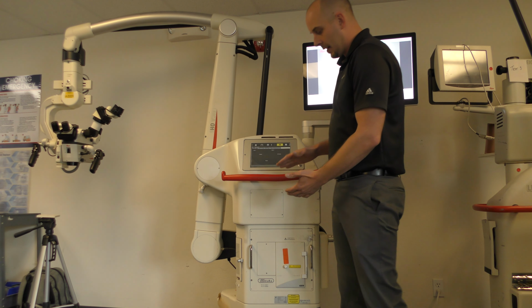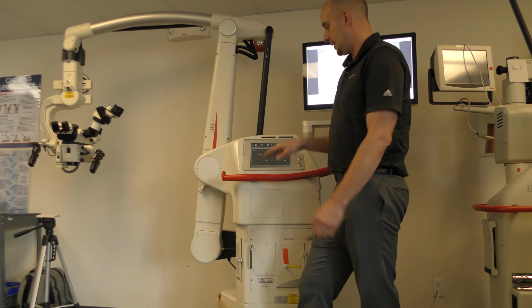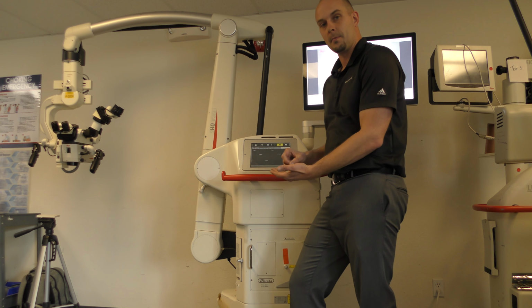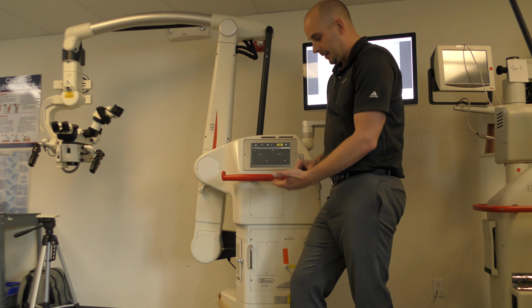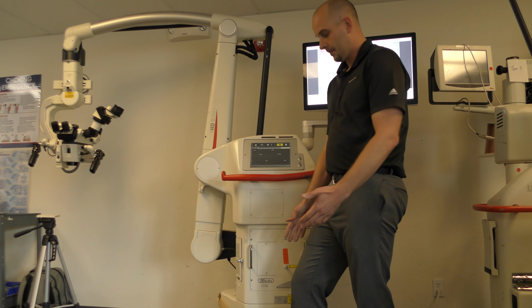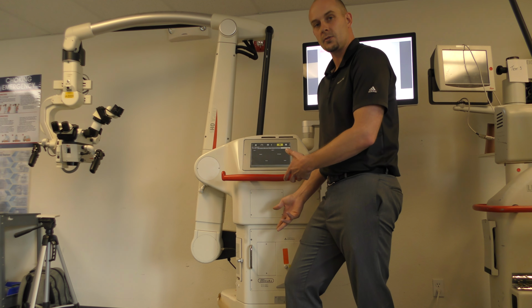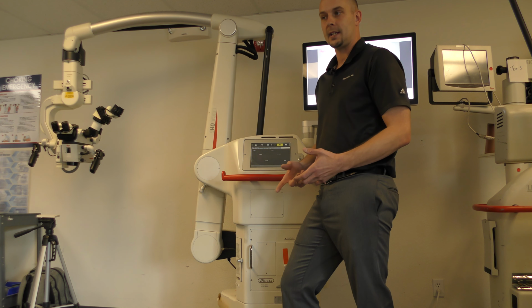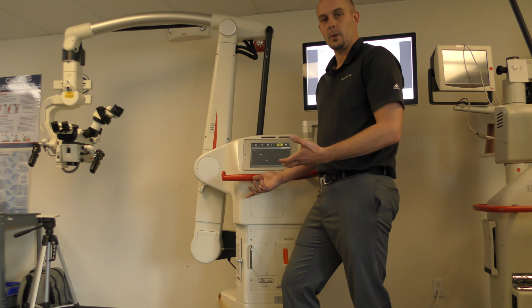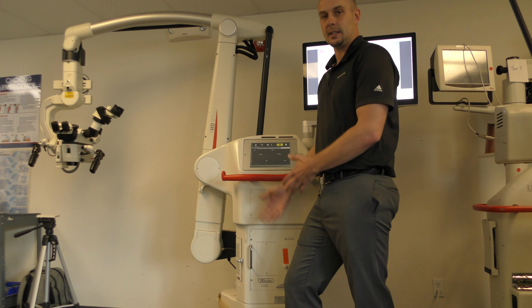When I come back out and I replace those bulbs, if it's an older unit, let's say an OH3, that doesn't have a bulb timer counter in here, I'll physically date the bulb module. I'll take a marker and date it. And I'll tell the staff, listen, next year when I come out, if the bulb timer's dead and we have a series of features that make me feel like the bulb needs to be replaced, I'm going to come back to staff and say, how often are you using the microscope? How many times a week? What are your hours per week that you're typically using this? And then I'll work backwards and figure out if they have exceeded their 500.